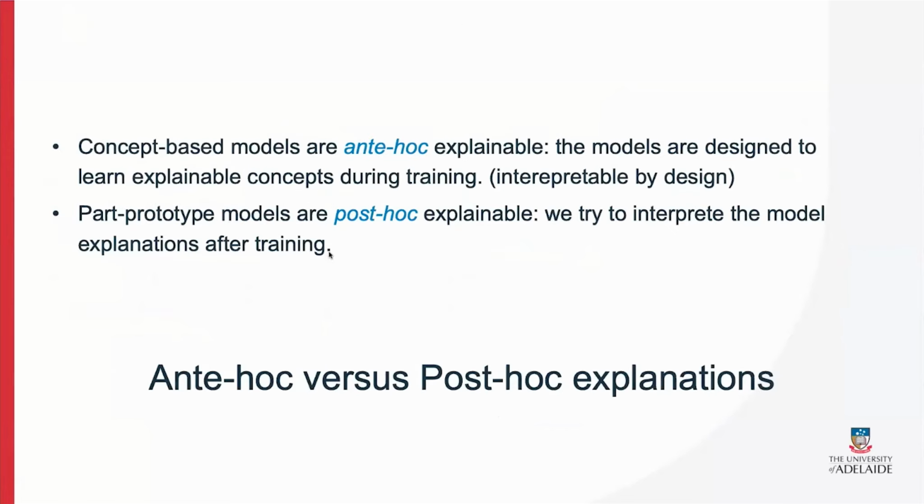So concept-based models and prototype models are two main explainable methods, where concept-based models are ante hoc explainable, where the models are designed to learn explainable concepts during training, while prototype models are post hoc explainable, where we try to interpret the model explanation after training.